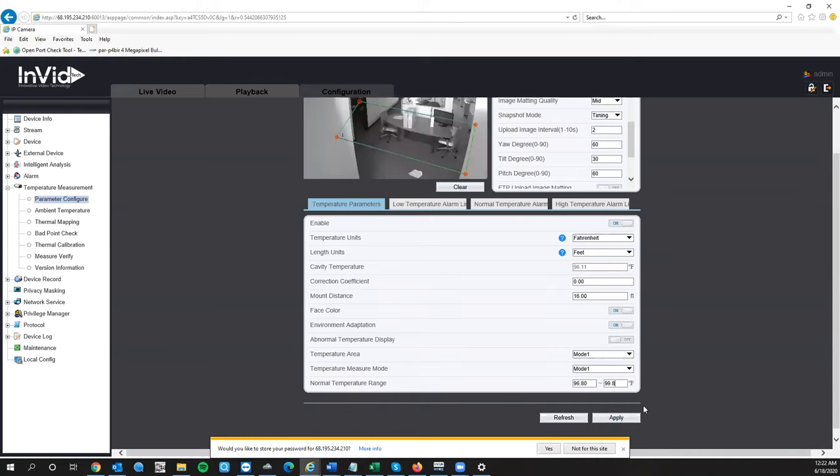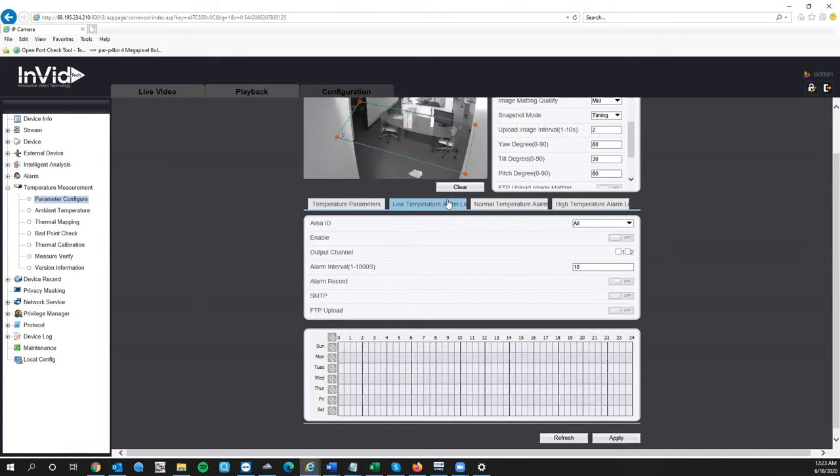The camera's accuracy is ±0.54°F. Some people set the high threshold at 99.5°F to be extra cautious; others set it at 100.1°F to avoid false alarms. After making those changes, hit Apply. Your low temperature alarm is really not going to be used. We'll cover that briefly, but you don't need it. The normal temperature alarm is for setting up something like a green light — we sell a siren kit that comes with a red and a green light, connected via the camera's dry contact alarm outputs (output one and output two).